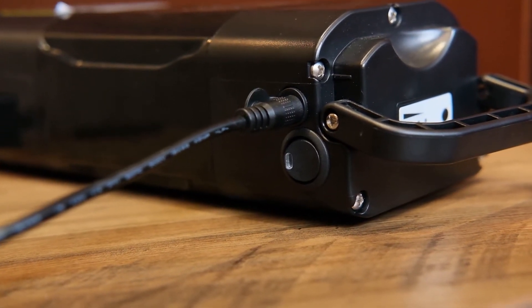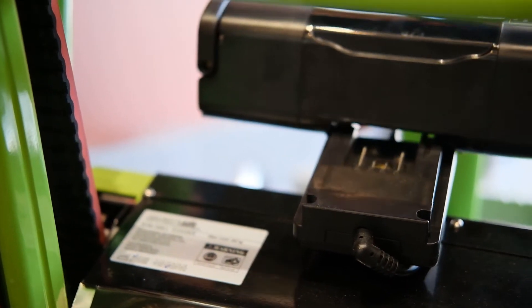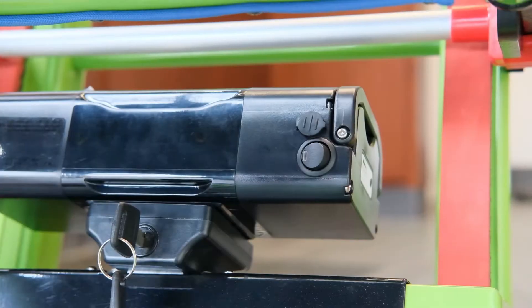The battery is now ready for installation. To install the battery, slide it into the battery housing. Turn the key to lock the battery into position and turn on the battery.